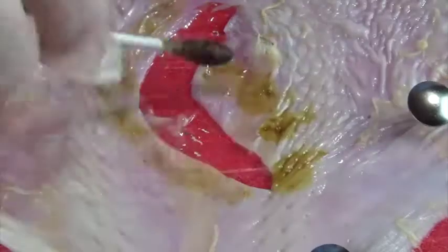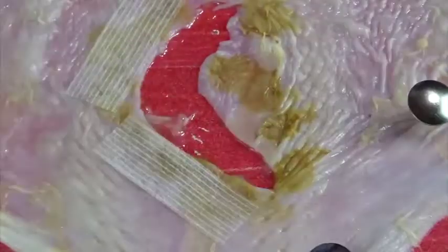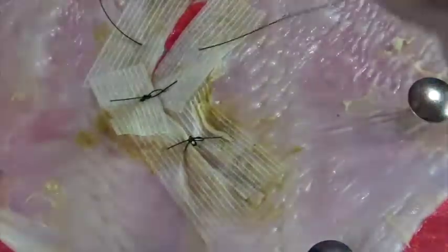If you apply some benzoin and steristrips to the wound margins, you can then suture through the steristrips and the skin together. The steristrip provides enough support so you can put tension on the suture without ripping through the skin. The steristrips simply stay in place until the sutures are removed about 10 days later.